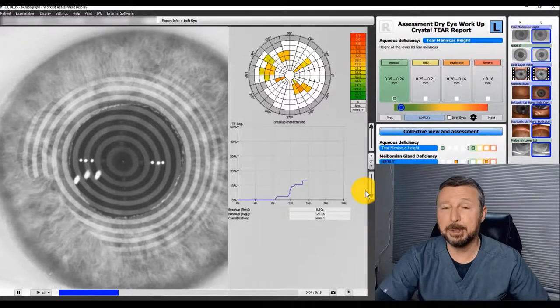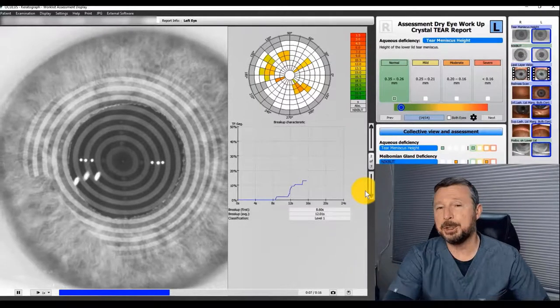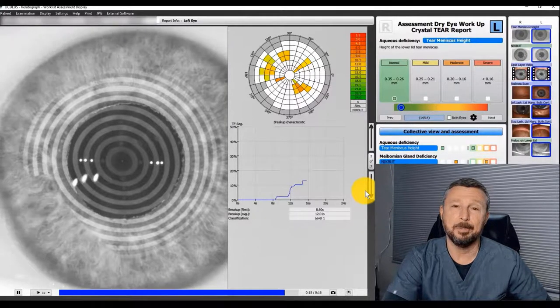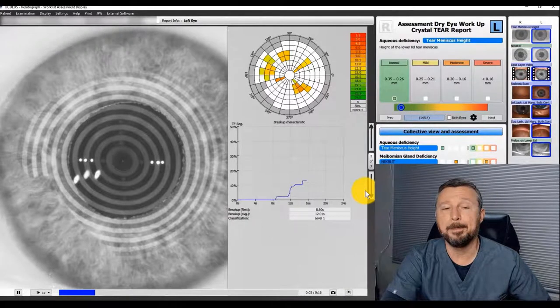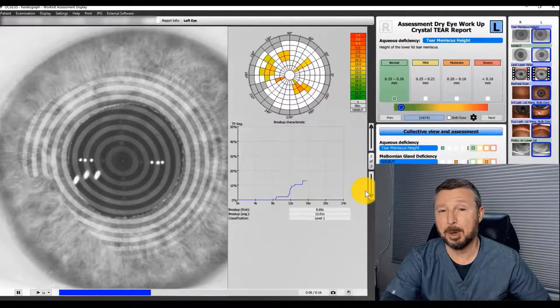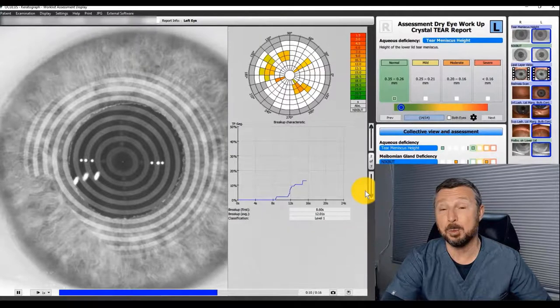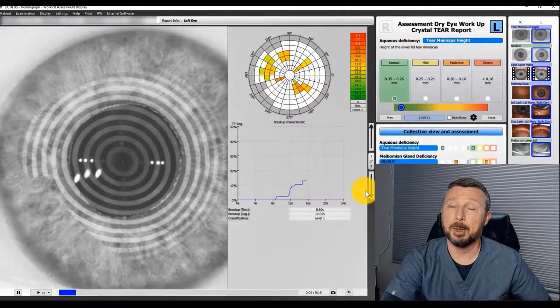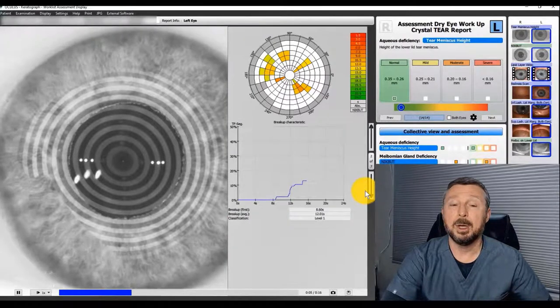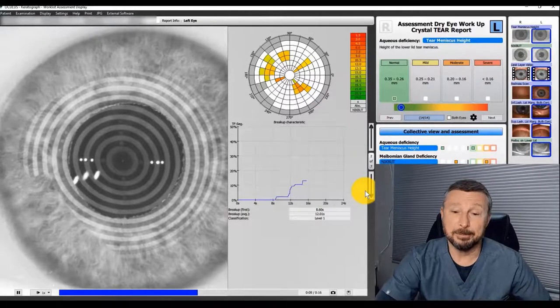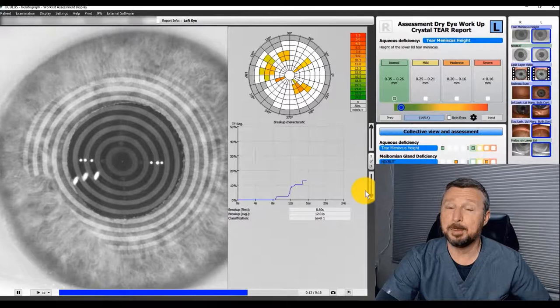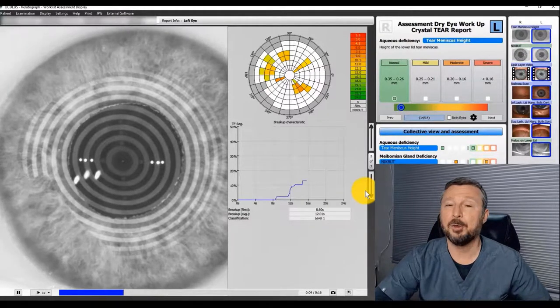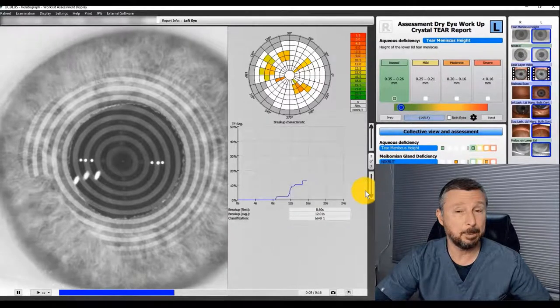When you blink and your lids come together, it's almost like a windshield wiper making a swipe — but unlike a windshield wiper, the lids don't take the moisture away; they simply smooth out the tear film. Eventually that thin layer of fluid across the surface of your eye will evaporate and break down, developing some dry spots. In a normal healthy tear film, that process should take between 20 and 25 seconds. If it breaks down in under 10 seconds, those people are usually pretty symptomatic. When we measure your tear film breakup time, it is just over 8.5 seconds — just under 10 seconds. That explains a lot why you're having difficulty, and it also causes fluctuating vision.